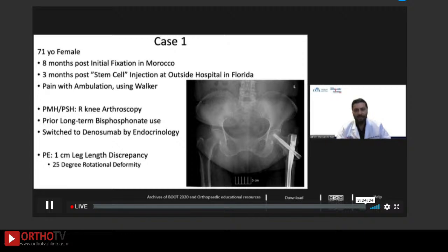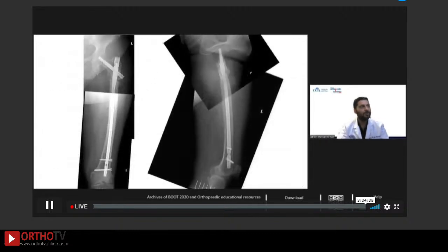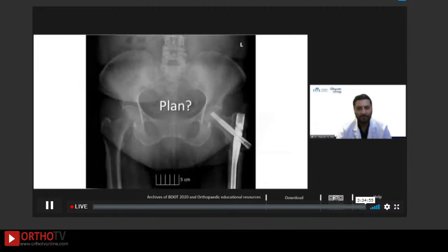And you can see that she's in varus there. So she has the typical deformities you would expect with a subtrochanteric fracture, with the proximal segment flexed in varus and malrotated. And it was just kind of nailed in situ there. So I'd like to hear from the group what they would do with this patient now.